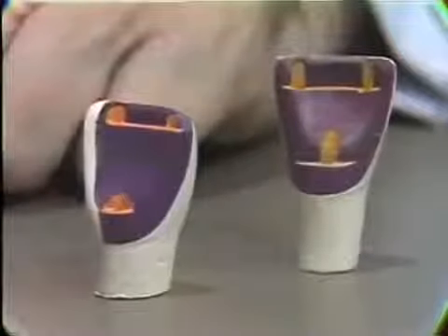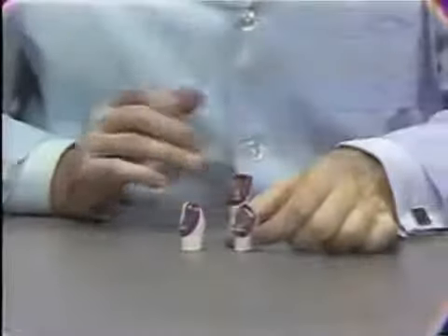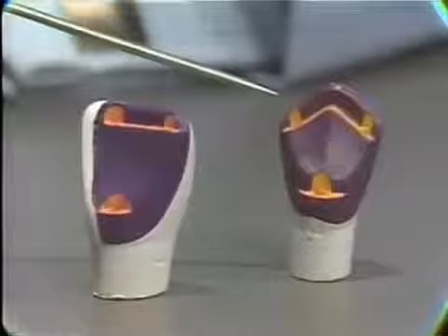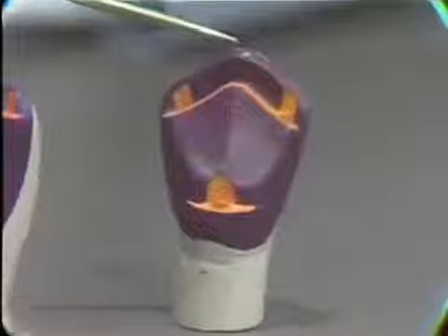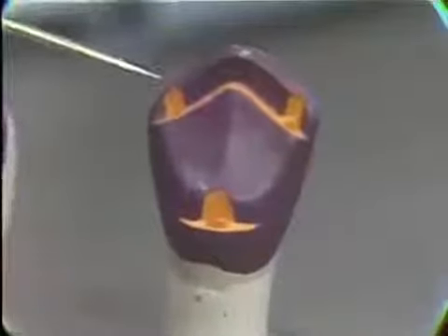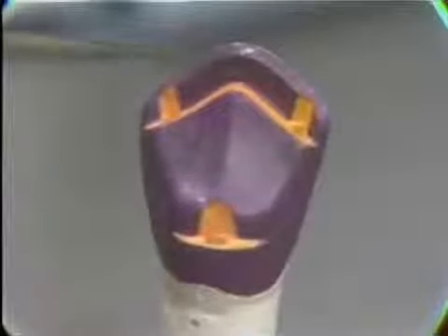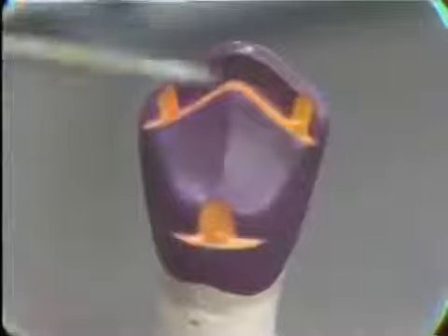This same basic preparation can be used on many teeth with a number of different variations. When it's done, for example, on a maxillary cuspid tooth or a mandibular cuspid tooth, then the incisal edge is modified a little to conserve the tooth substance, and instead of running straight across has this rooftop situation that you see in this particular model here. Again with three pins, one at either end of there and one on the cingulum ledge.